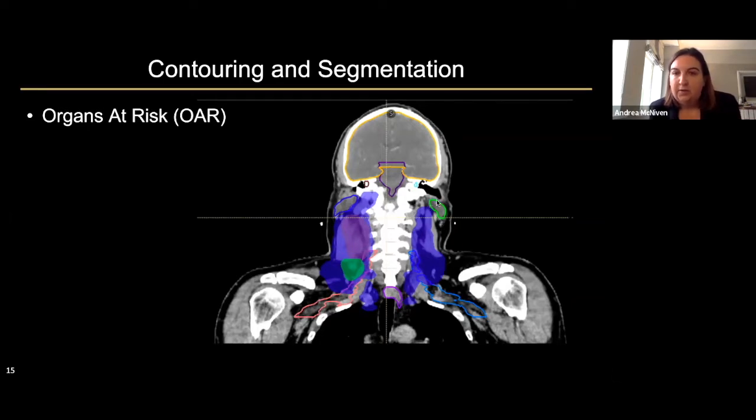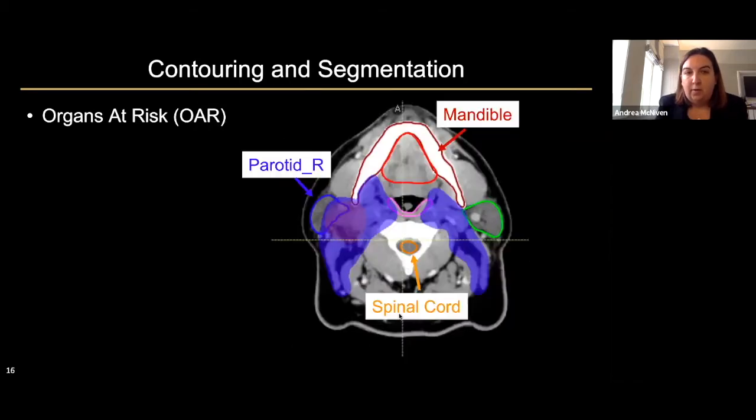And the contours that are not filled in are some of the organs at risk that we contour for head and neck, so we can assess the safety of the plan. And this gives you an idea of how extensive those volumes might be. To give an example a bit closer, we've got an axial slice again here with those targets in color wash.